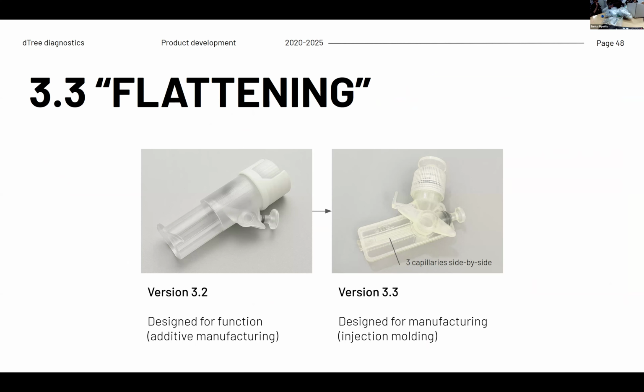We also, if you notice between this version and the one I'm holding in my hand, is missing the two plungers. We realized we actually don't need those two plungers anymore. We can either create a vacuum chamber in these chambers themselves, so that by the time it sees liquid or anything higher pressure, it will just transfer over.